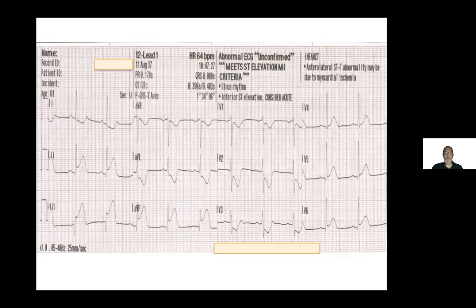which means in addition to doing a right-sided EKG, which is simply taking V4, putting it on the right side in its mirror image and relabeling it V4R, I'm going to take V4, put it on the right, and I'm going to take V5 and V6 and move them around to the back and convert those to leads V8 and V9. Now I've got what's called a 15 lead ECG, and I'm going to run that tracing again. So that way V4R is looking at the right ventricle because that's my diagnostic lead, V4R. V8 and V9 are looking at the posterior wall.